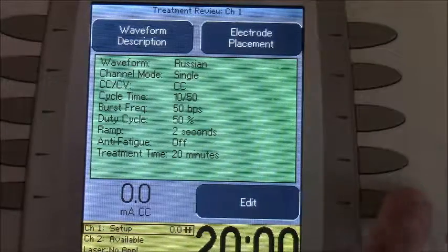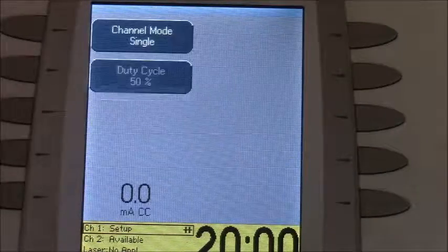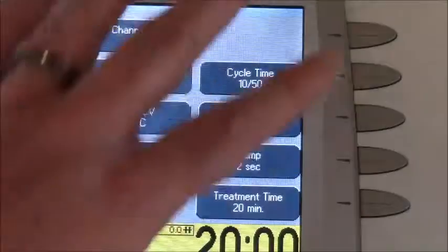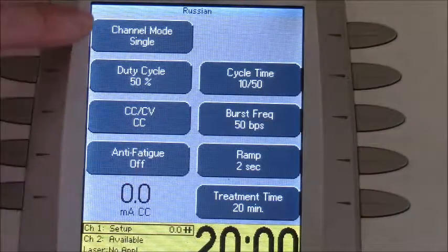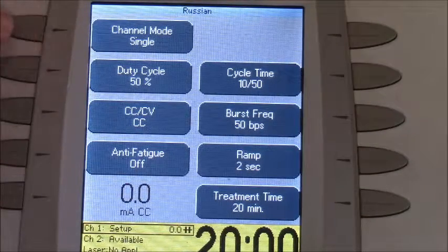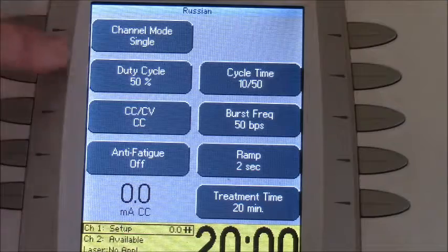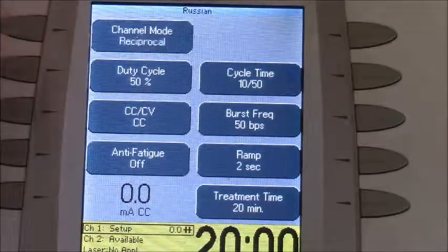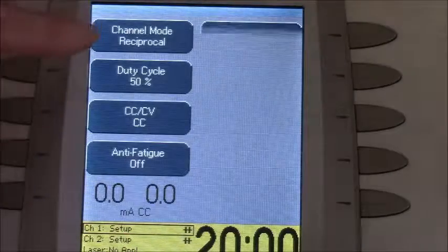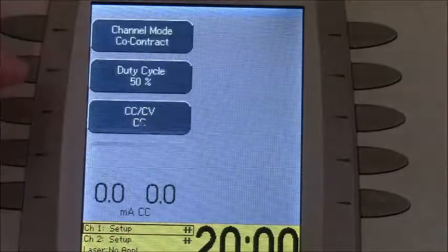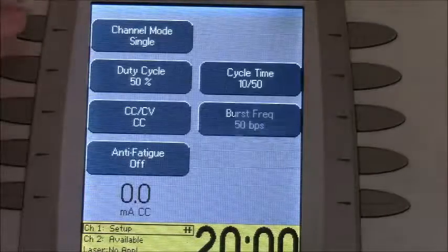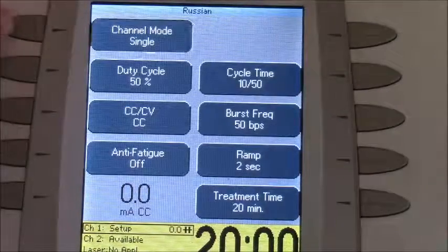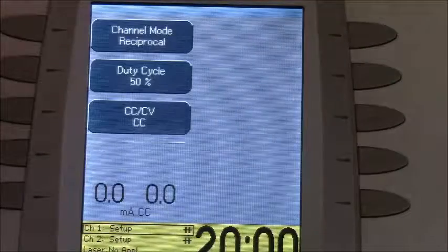Click on the edit button, and that brings up every parameter that you're going to be changing. The first one to change is channel mode — click on that and it's going to bring up reciprocal. That's also what gives you the co-contraction. We are going to reciprocal mode.